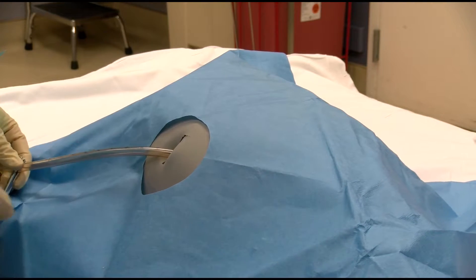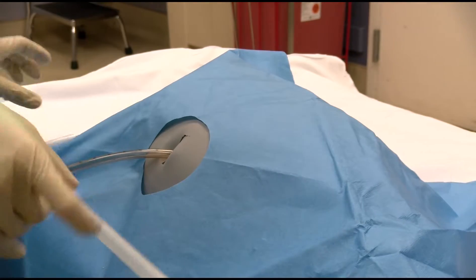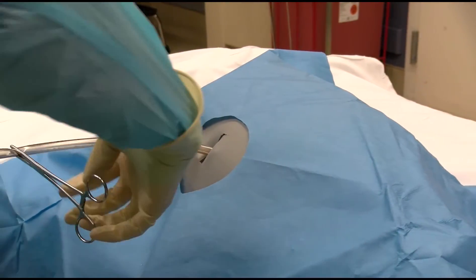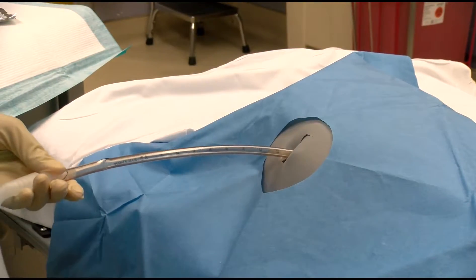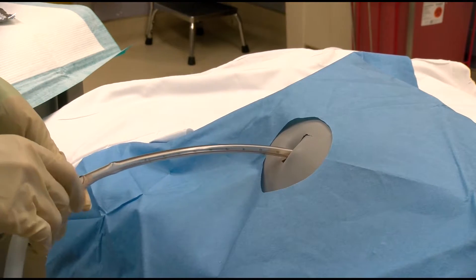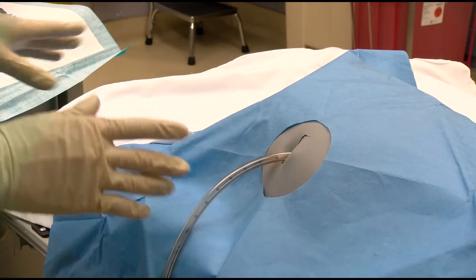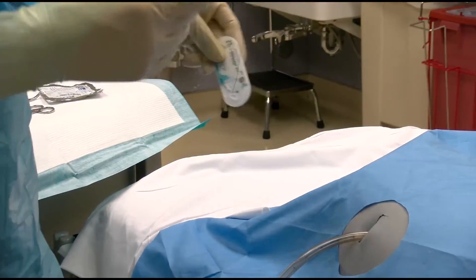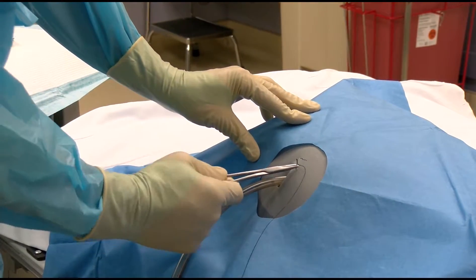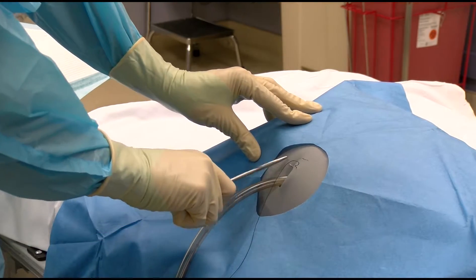Once the tube has been inserted and directed posteriorly and superiorly, it may be connected to the chest tube drainage container, being sure that the tube is not pulled loose prior to being fully secured. A 2-0 silk suture may be passed in a purse string or horizontal mattress stitch around the tube to close the wound margins around the tube.